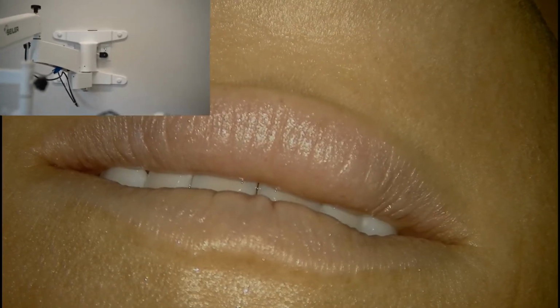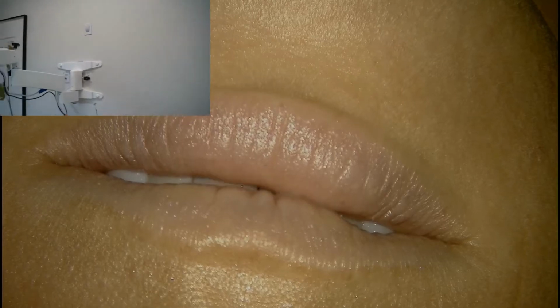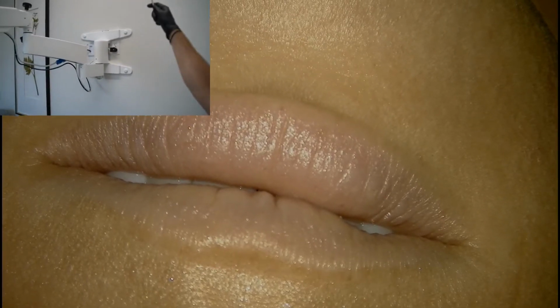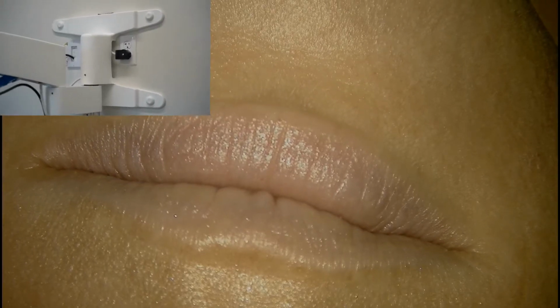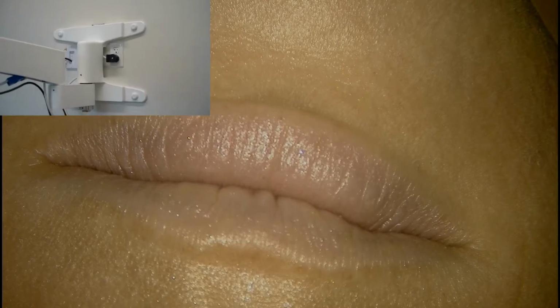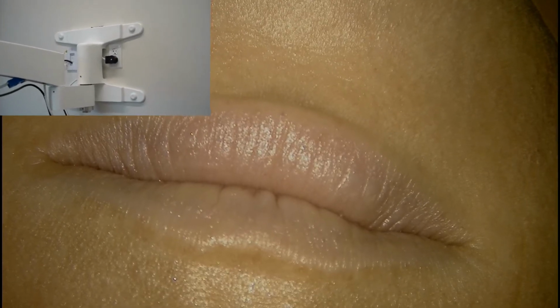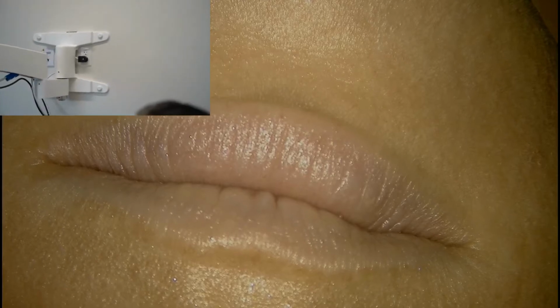The high mount obviously is high, and sometimes, just for where the room position is, you'll put it up really high up here. And then it has a swing arm that comes down, so when you're sitting, it's at arm's reach where you can grab it and bring it over. And I think that's how the mount goes on the wall.